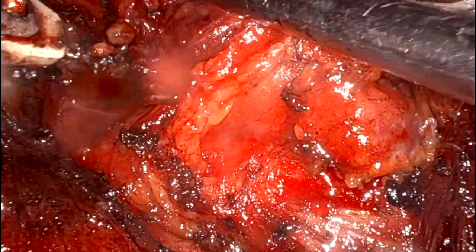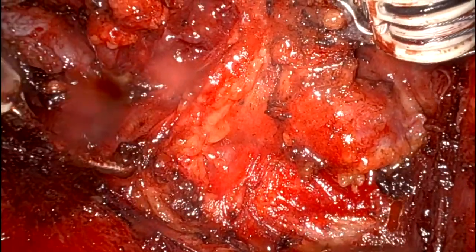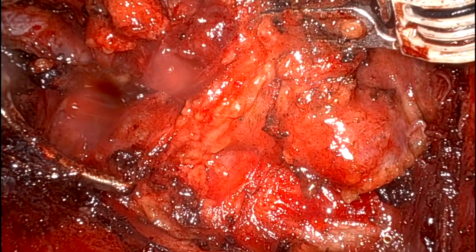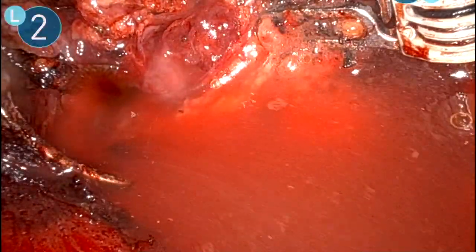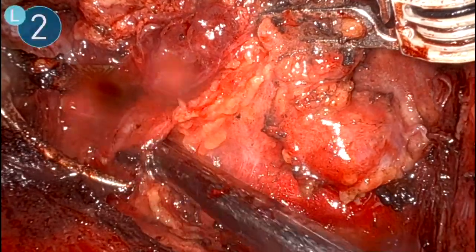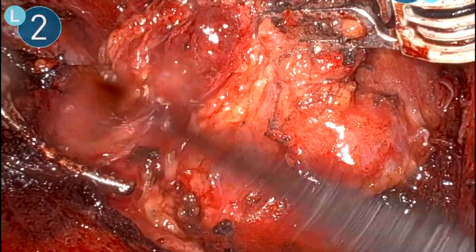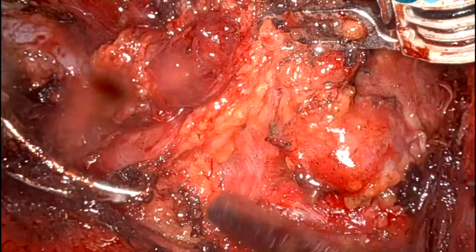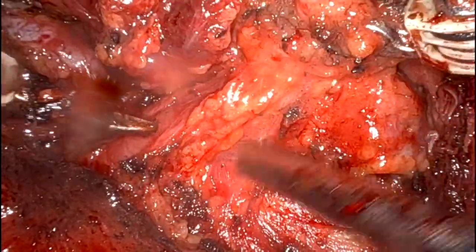Don't you think we need saline wash right now? Here we go, and we have saline wash. Now see the magic. Good saline washes, placement of correct retractors at correct places, good hemostasis are few small things which create a very big difference in your surgery.